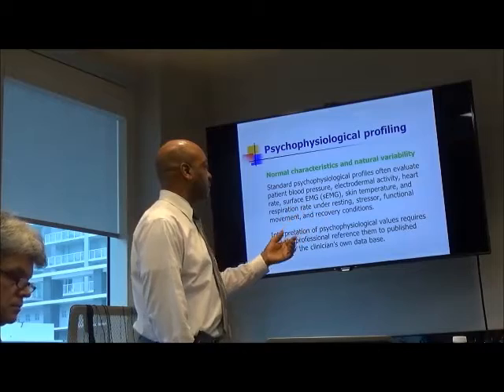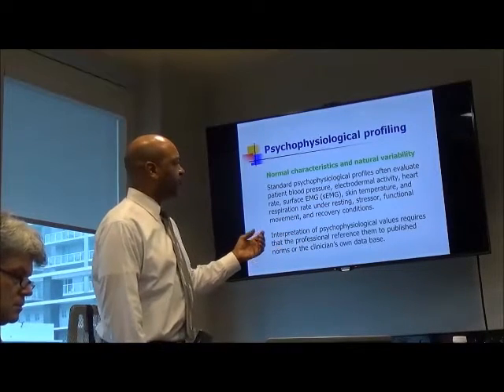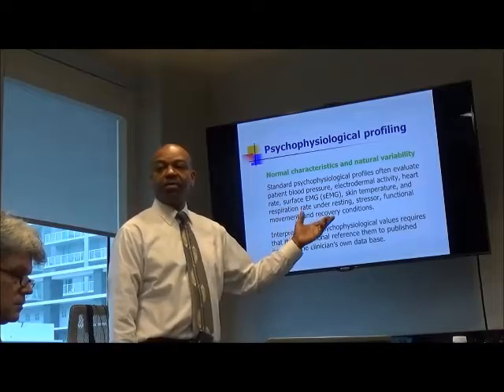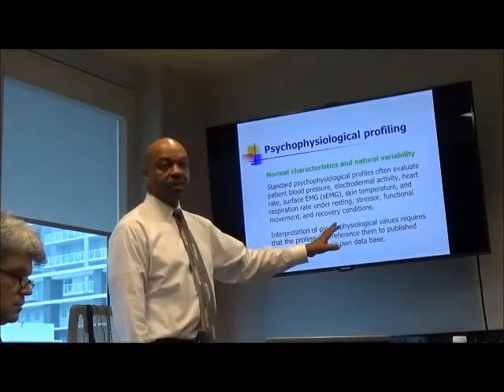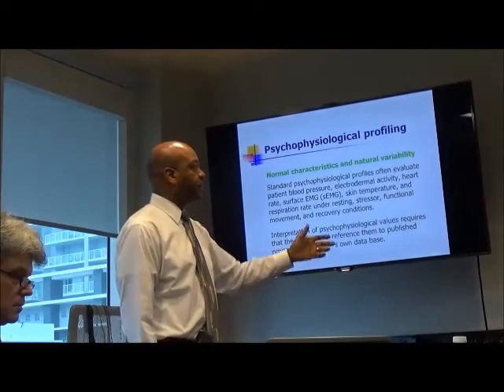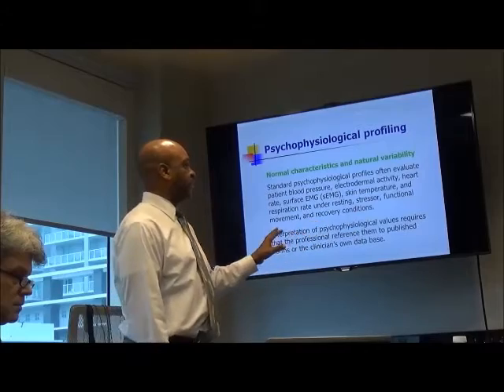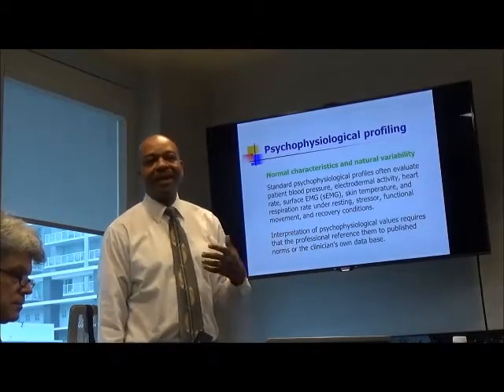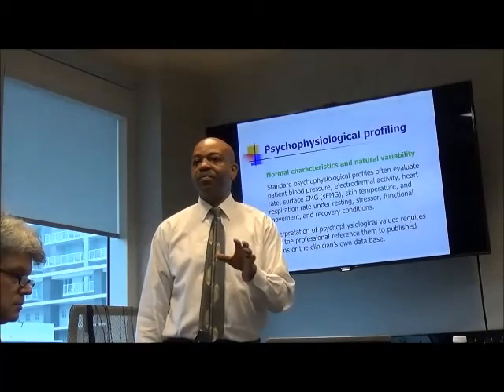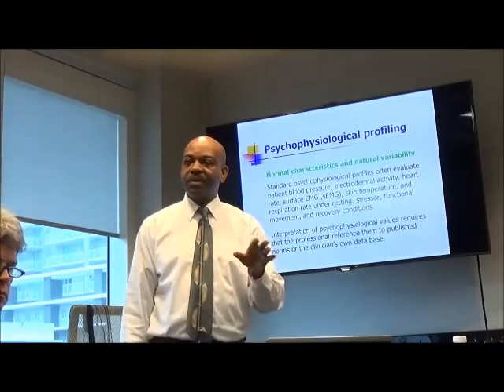Then you have skin temperature, respiration, and what we're looking for is what all of these levels are doing in a resting condition. So that would be like your baseline. Stressor condition. Here they're saying functional movement, but I consider functional movement maybe something different than what would be included in the stress assessment.